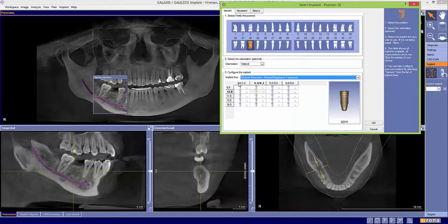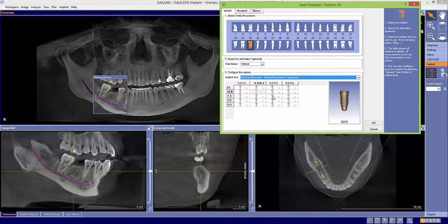As you can see here, the diameters are listed on top and the length is listed on the side. Select OK.